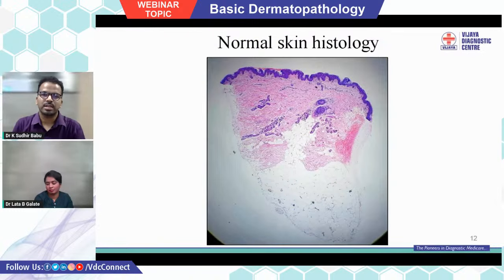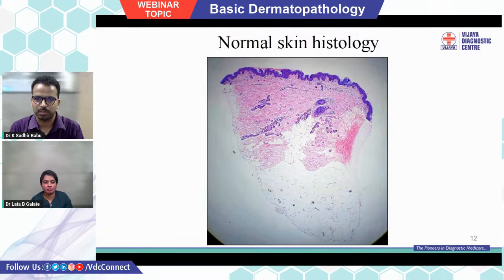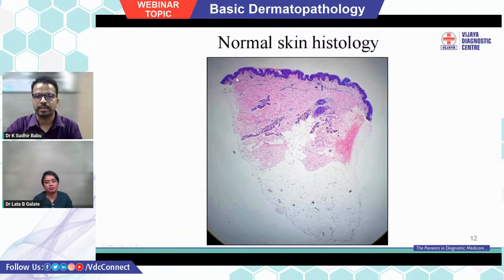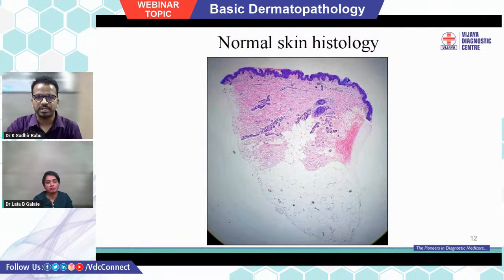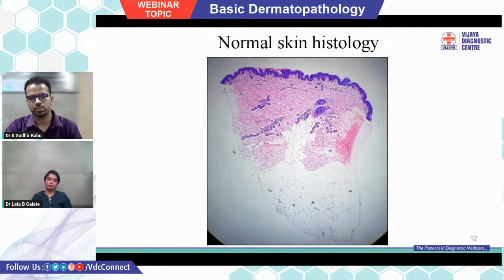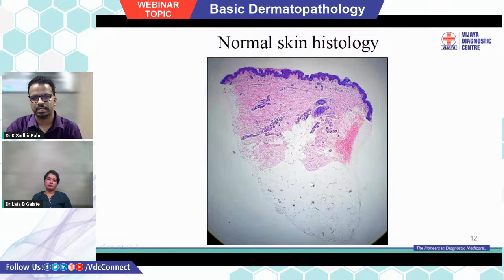With this knowledge, let us look at a normal skin biopsy slide. On the top you can see a blue color layer — the epidermis — because it has more keratinocytes and so more nuclei, making the predominant color blue. The dermis is mainly pink because it has collagen. The subcutis shows white space because adipocytes contain lipids that get dissolved in the alcohol used in tissue processing. So we have epidermis, dermis, and subcutis.